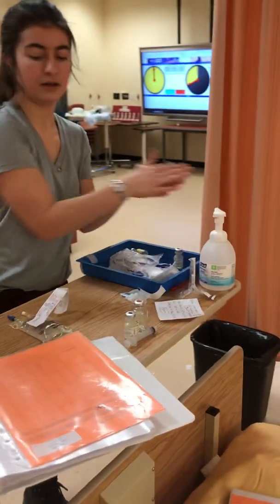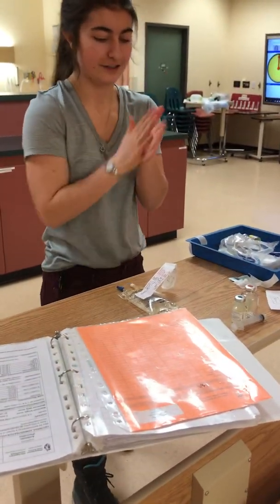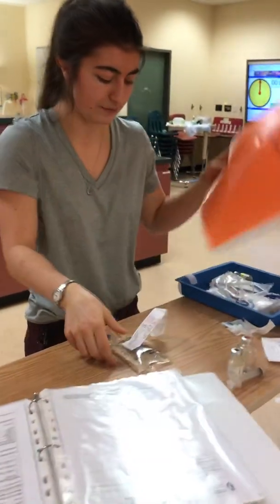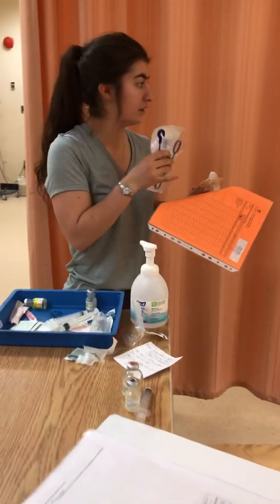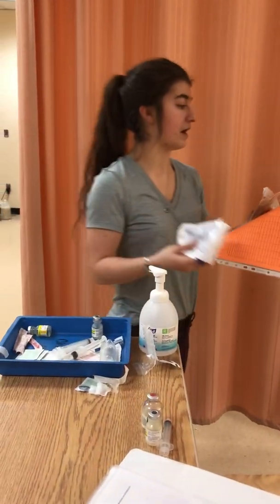Alright. I'm going to do some hand hygiene as I walk into the room. This is really wet hand hygiene. Alright, I'm going to bring my supplies. I have my line, I have my math ready to do once I'm in the room, and I have everything else. Okay, as I'm coming into the room, I'm doing a safety check of my patient.